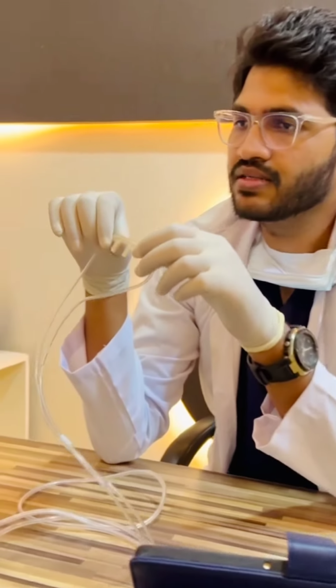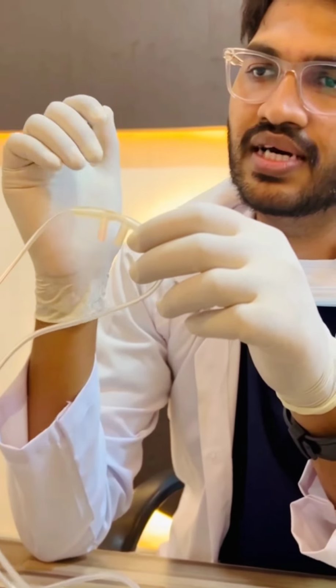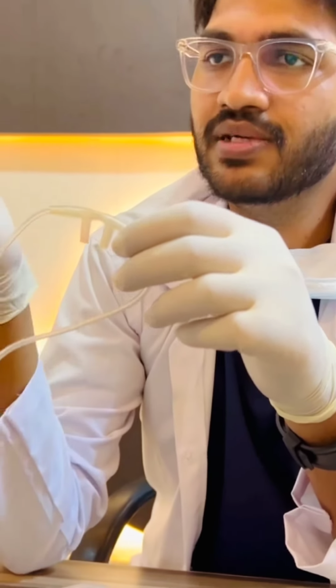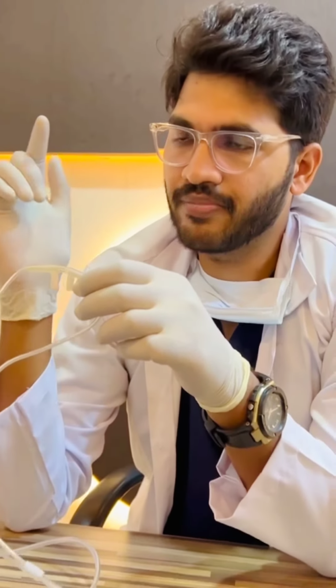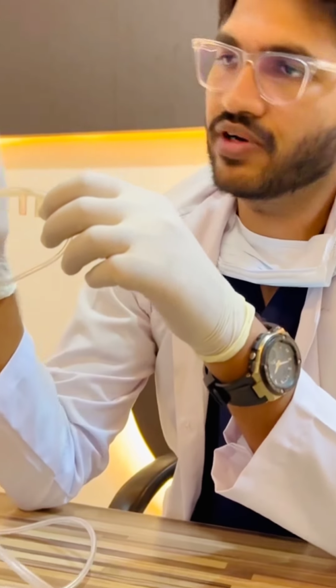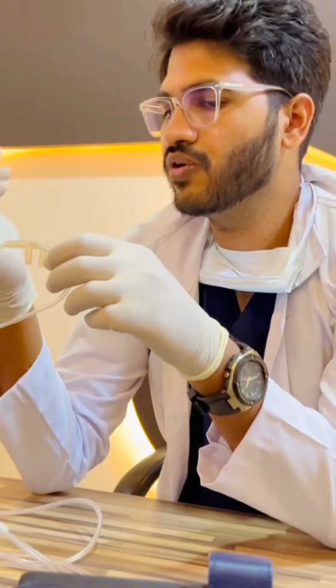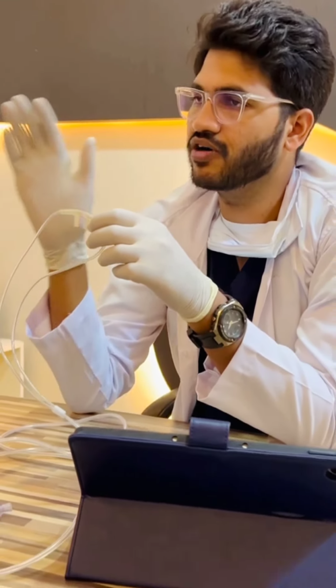So I will talk about the nasal prongs or nasal specs. It is a nice way of delivering a small supplementary amount of oxygen. They are convenient and more comfortable than a face mask, and the patient can eat or drink with nasal specs. But the negative point is we can't use a high rate of oxygen, we can only use a low level of oxygen. That is around 2 to 4 liters per minute, which is equal to 28 to 35% oxygen.